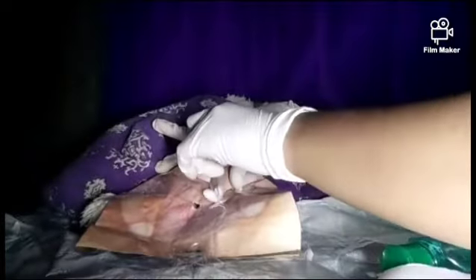And get another one and do this with the opposite side and discard. And the rationale for this is cleansing the perineal area prevents the introduction of bacteria and prevents the spread of microorganisms.